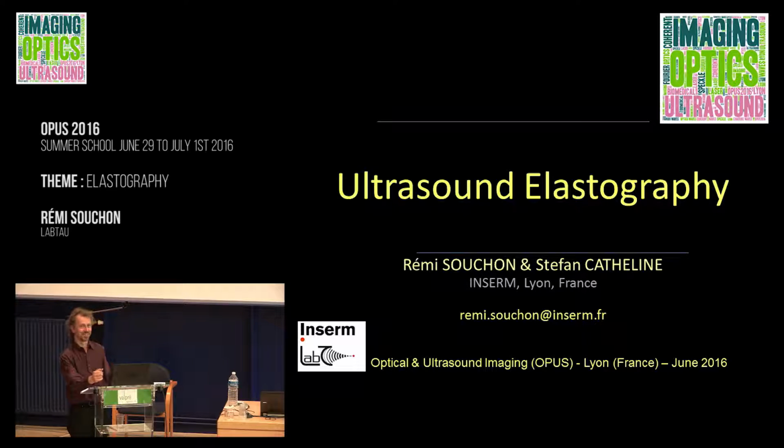That's a very good question. Because I've oversimplified for the sake of time and simplicity here, the displacement is actually a 3D vector. It's not just a scalar as in this slide. So as we get 3D displacement, we also get lateral displacement that will go from one of these A lines to the next. And we can partly pick them up with our algorithm if they stay within the imaging plane.